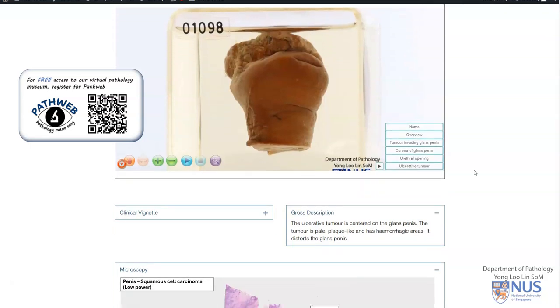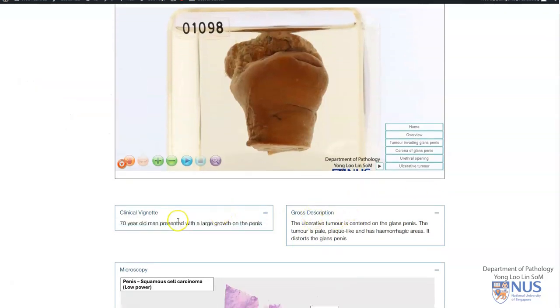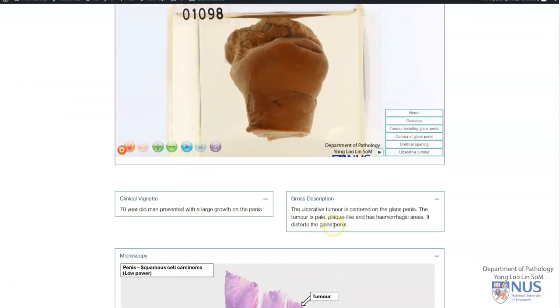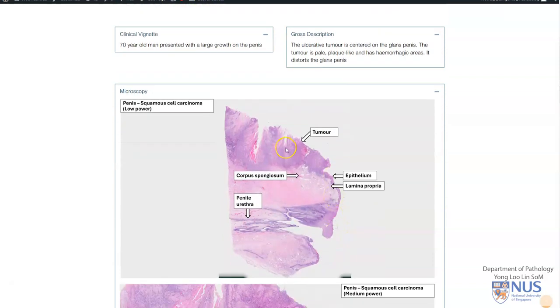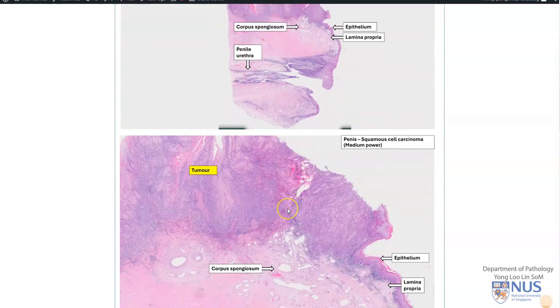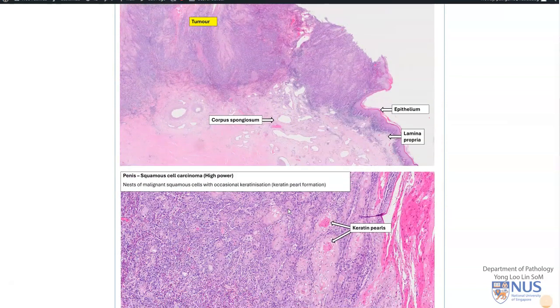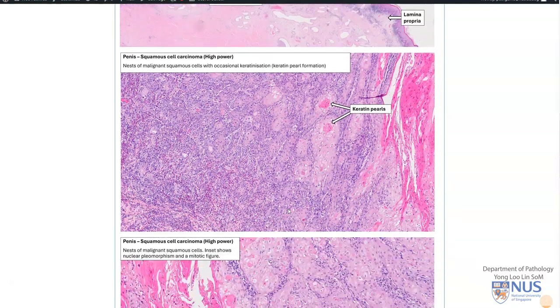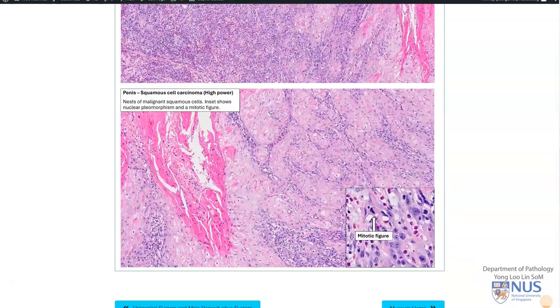If you scroll down on this page, you can see additional information and also some annotated microscopy pictures of squamous cell carcinoma of the penis.